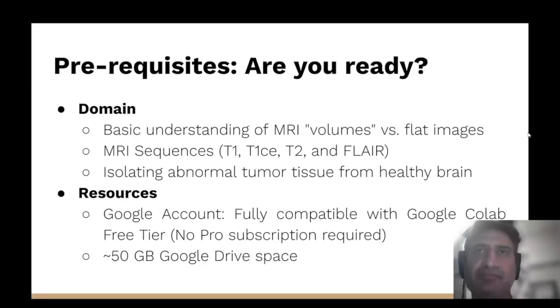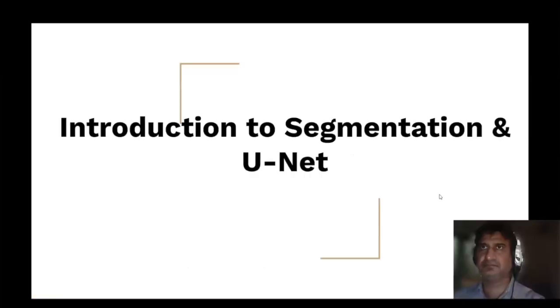However, because medical data is large, please ensure to have about 50 GB of free space on your Google Drive to store the dataset and your model checkpoints. And if you have that ready, we are good to go. Now that we have the overhead view, let's dive into the core concepts.